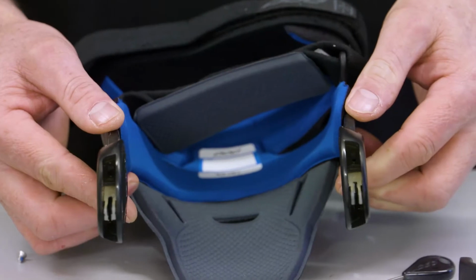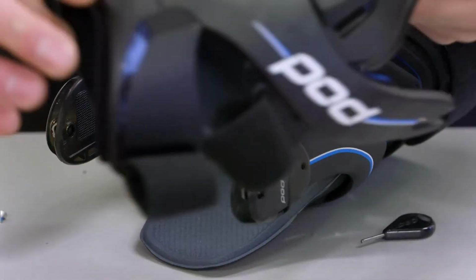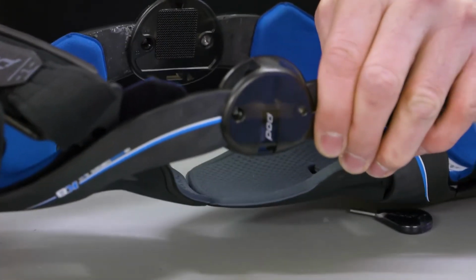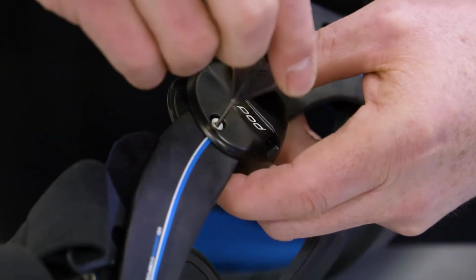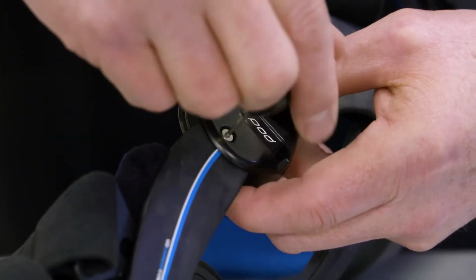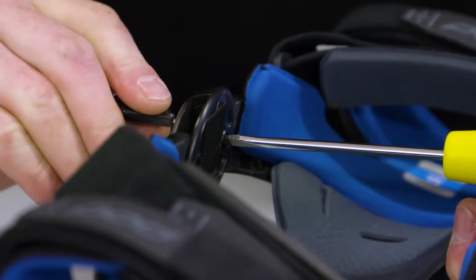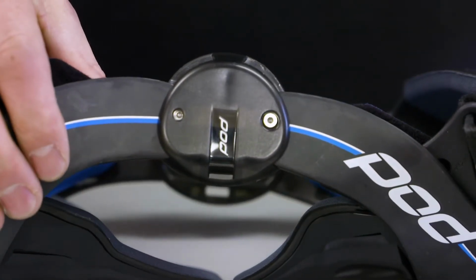Now that they're in place, you can reattach the lower frame. So you can slide the lower frame through the hinge housing and connect it to the ligament. And with that now connected, repeat by putting the male and the female screws through the bottom lower frame and ligament. And then once they're tight, we'll move on to the patella attachment.